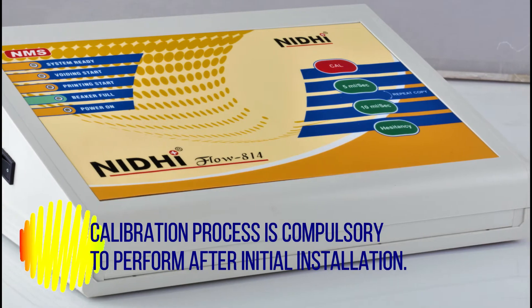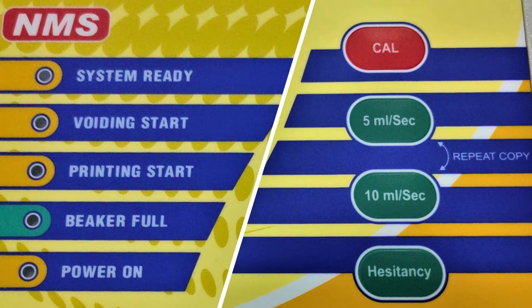It is compulsory to perform after initial installation. We will use this calibration switch given on the module and observe these LEDs during the entire calibration process.